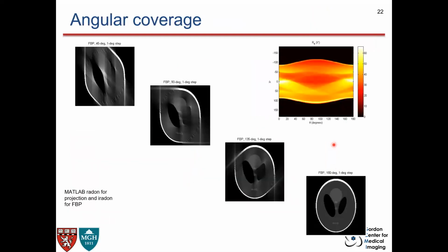So for gamma camera and SPECT imaging, there are multiple things that you have to think about when you're acquiring projection. I showed you before in the sinogram space that you want to have a full sinogram, right? That means your angular coverage should be good enough, and your angular sampling also should be good enough. These are two different terminologies. I'm going to show you here what they mean and how we can go about them.